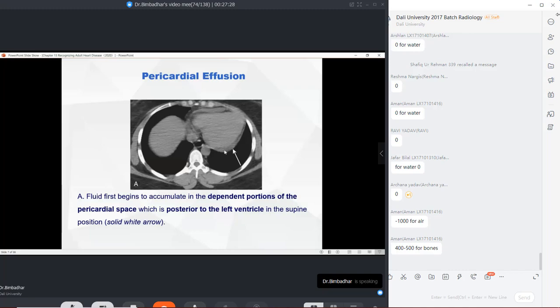First I'm going to measure the length from this shadow to this shadow and see if it extends beyond 1 centimeter. If it is beyond 1 centimeter, I will understand that yes, there is an increase in the cardiac diameter on the posterior side. And this diameter is increased indeed because of this fluid attenuation on the posterior side, which means I am talking about a pericardial effusion.